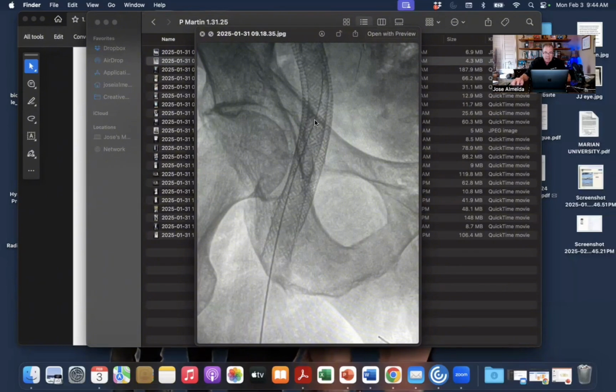We relined the old stent with a new stent. You can see that the new stent doesn't fully deploy against the old stent because we could only recanalize the thrombus, do hyperinflation of the balloon, and push everything to the old stent wall. So when we relined, we lose lumen every time. So you can only do that twice, maybe 3 times, and then you've lost all your lumen and you have to give up and depend on collaterals.